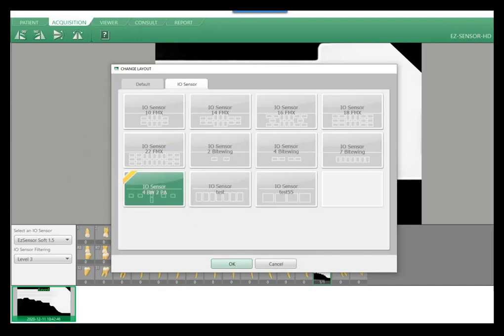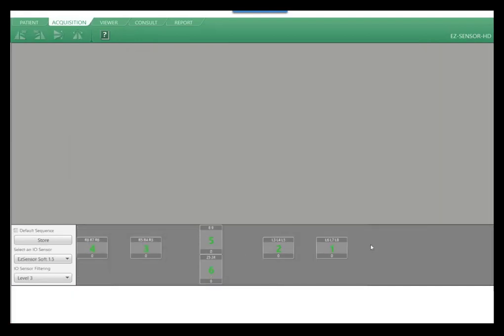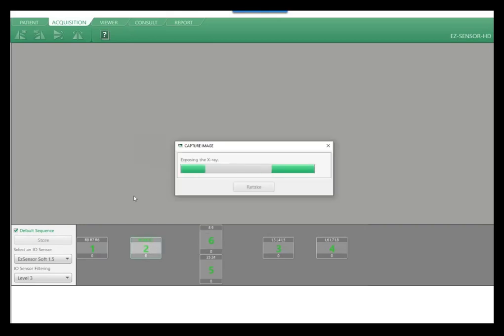So I'm thinking the double click feature. So let's say I've taken 1, 2, 3, 4, and I want to go back and take number 2 again. Right. So I would come here and I would double right click here, and it's going to go just to that tile, and we're ready to take that image there. Okay. So just a double right click on any of those layout frames. Correct. And I do have it ready, and you can see the green light versus the blue.